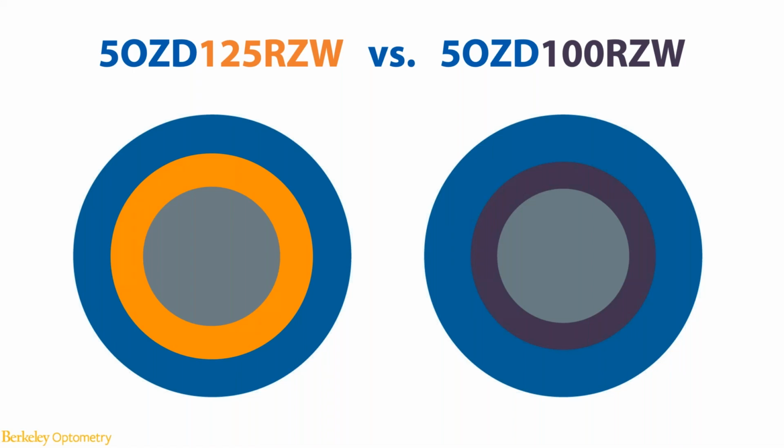Related to this study, we aim to answer the following questions. Number 1, how reliable is the change on the lens design being reflected on the change of the corneal shape? After all, it's the shape of the cornea that matters in the patient's daytime vision for Ortho-K modality, not that of the lens. The second question is, what other factors other than the optic zone diameter play roles in determining the post-Ortho-K corneal shape? And number 3, if there are multiple factors at play together, what are the underlying interacting mechanisms of having these significant interactions?